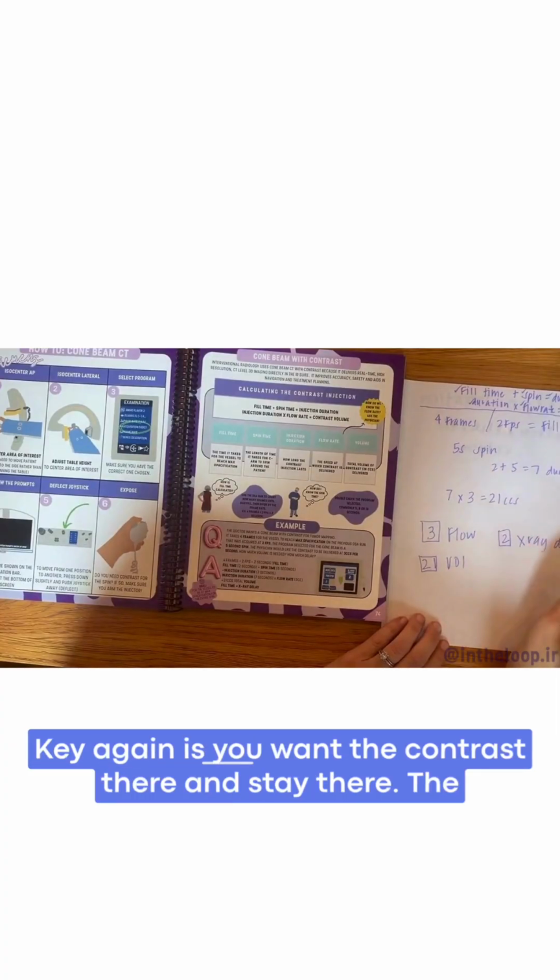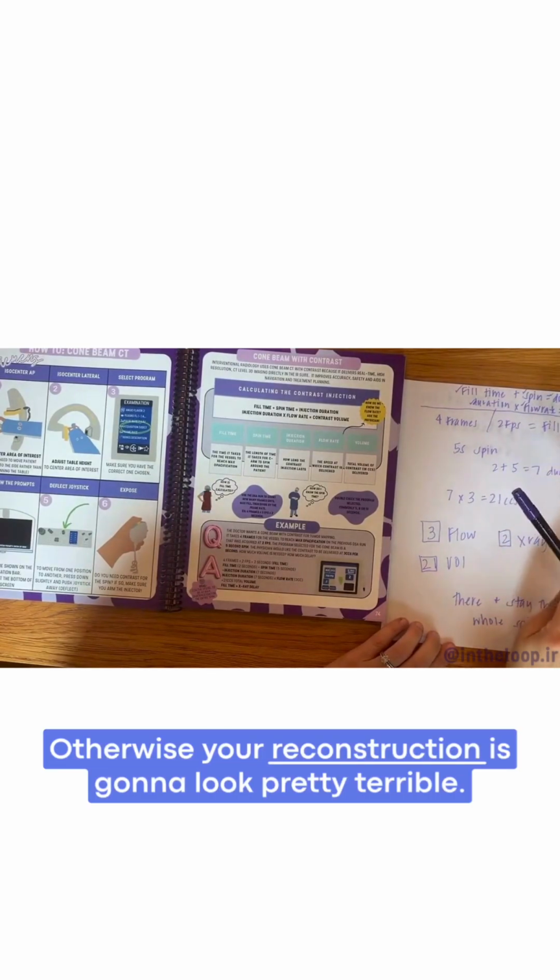The key again is you want the contrast there and stay there the whole spin. Otherwise, your reconstruction is going to look pretty terrible.